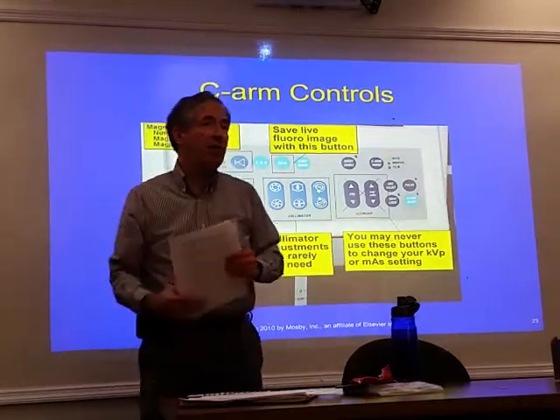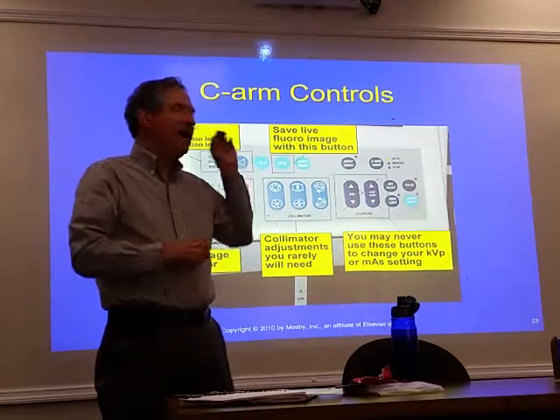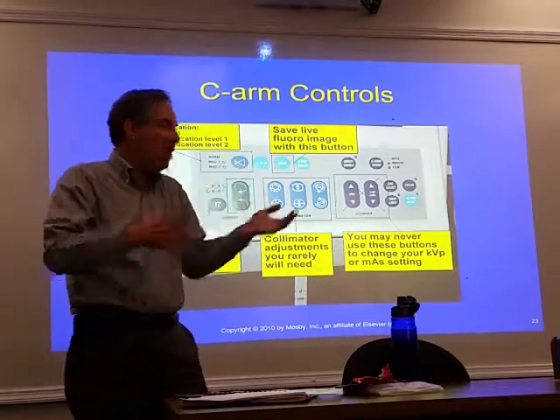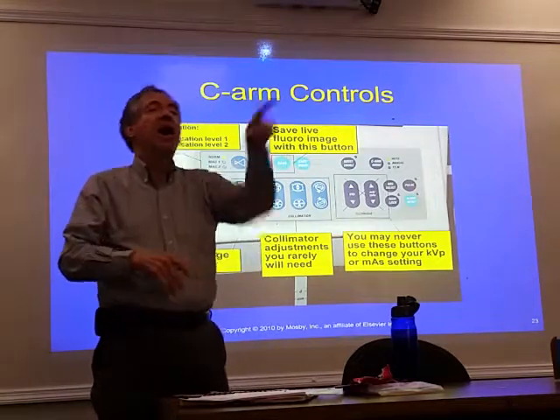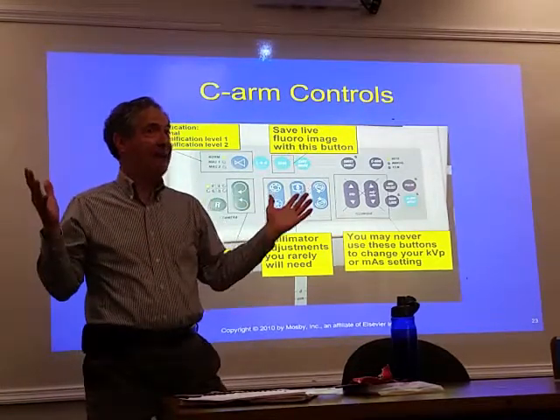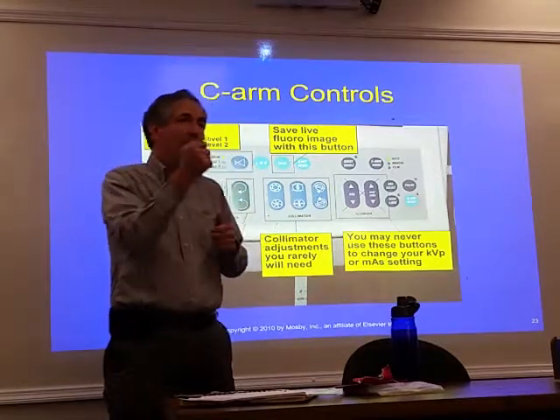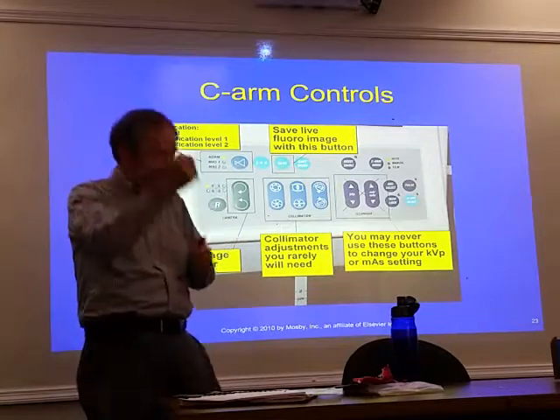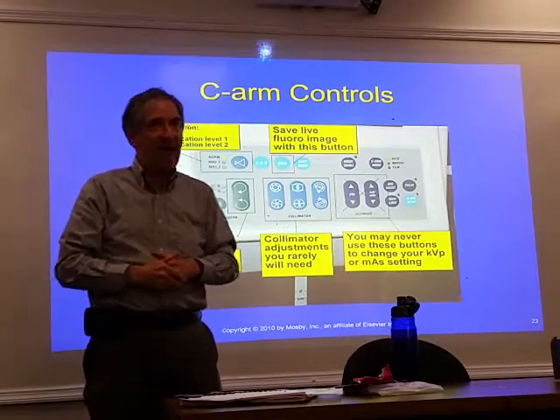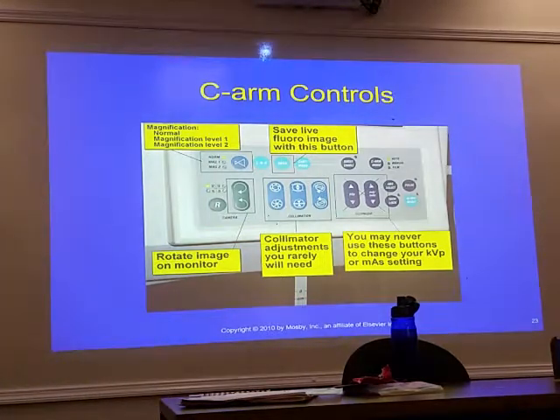Because this is what happens with me. What happened to me a few times, didn't happen many, is that you do a case and you didn't save anything and the doctor says, I'd like to get a picture of the last 4 images you took. It's like, I wasn't saving it and it wasn't set up to save. So if you think that it might be good, towards the end of the case, just hit that save button a number of times and that way you have it. I learned from experience the hard way to do that.